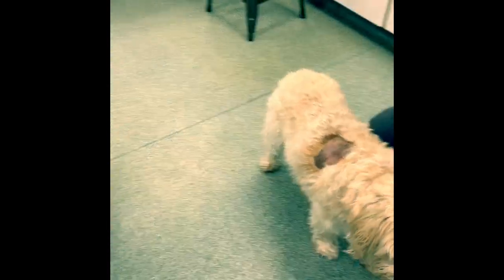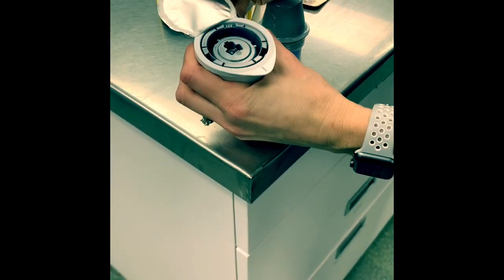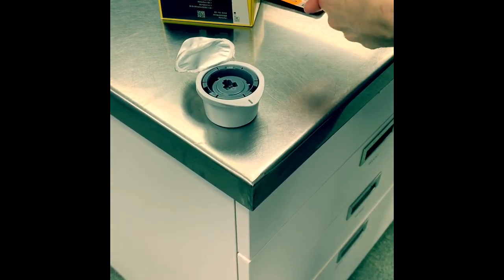We've got our sensor from the human pharmacy and we open our little package and we've got our sensor and our application tool.